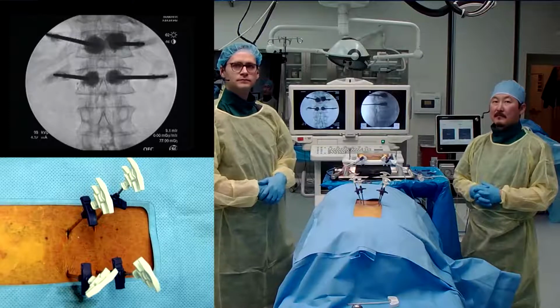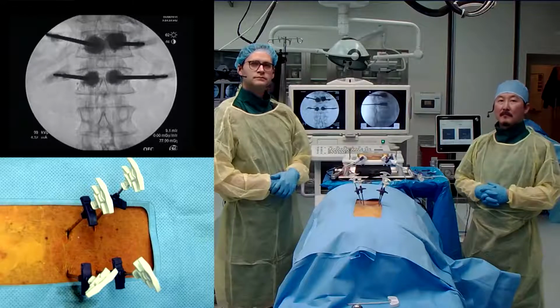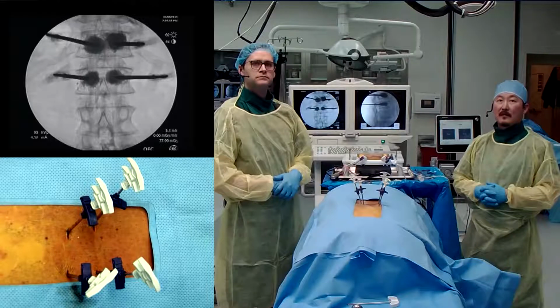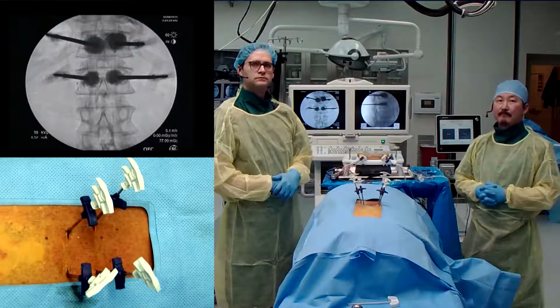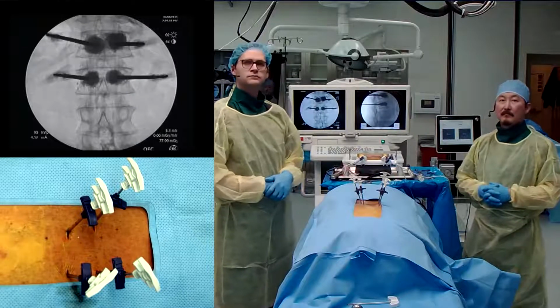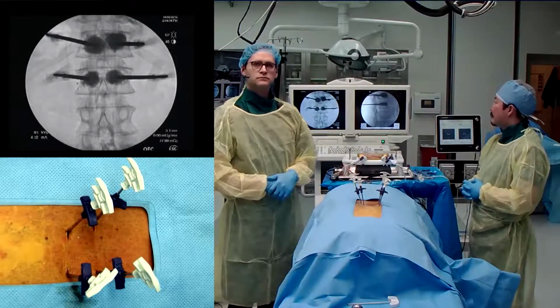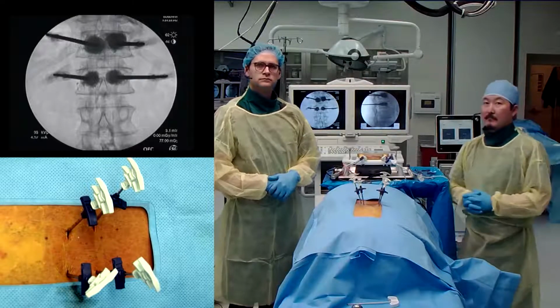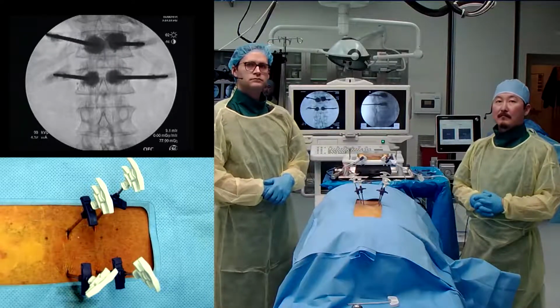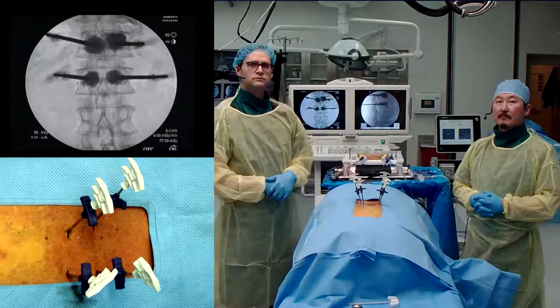The way I approach this is I actually don't place the needles in a pure AP view. I put them in more of an oblique view that gives me a little better safety margin of advancing along the pedicle. But either way you do it, when you advance the needle and reach that medial wall, check a lateral. If you're not in the vertebral body at that point, you can't keep advancing that needle because you're now in the danger zone. You can advance up to the medial wall, and once you're in the vertebral body, then you can keep advancing.